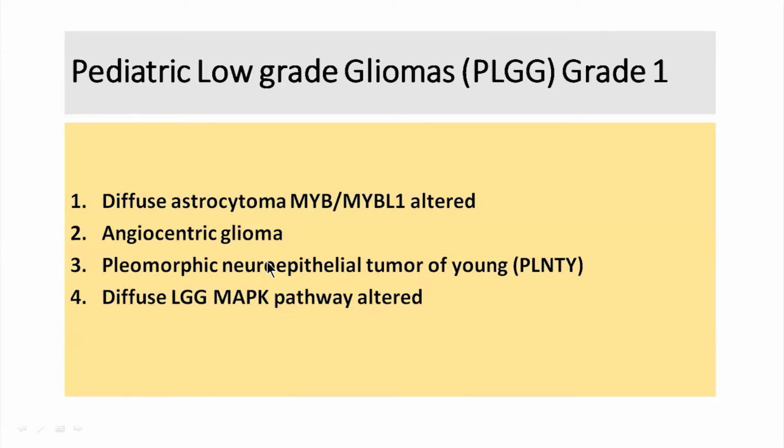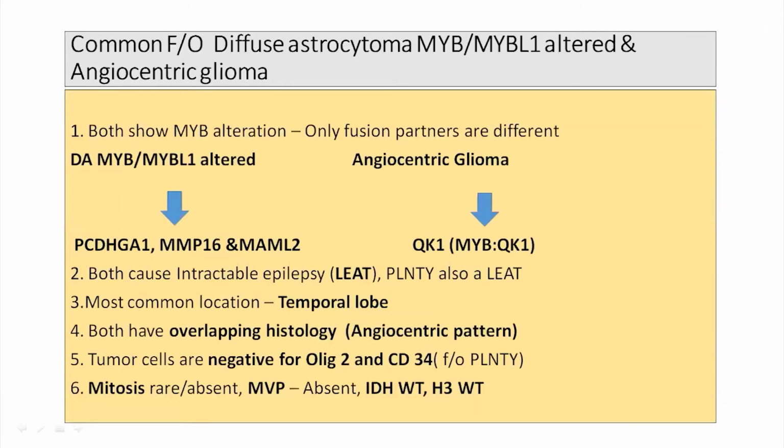So, Gaurav, just to clarify, both ependymoma and angiocentric gliomas are GFAP positive, and they are OLIG2 negative, and they can show EMA dot positivity. So, how do we differentiate them, because angiocentric glioma is also a morphological diagnosis more than anything else initially. So how do we differentiate it from ependymoma? Because ependymoma can also occur in an extraventricular location. It's not necessarily that you see ependymoma in and around the ventricles.